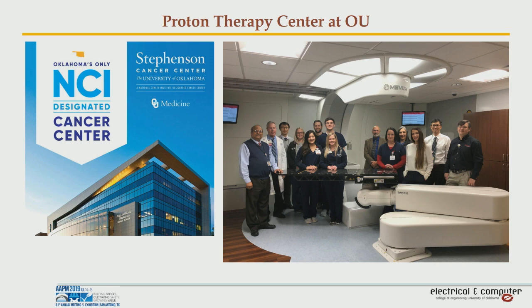We have a very interesting machine in the proton center, a synchrocyclotron proton machine, and luckily we can change the pulse width to a very small pulse duration, so it's likely to produce a high frequency signal. So we hope we can get a very good signal from the clinical machine. And I'm working with Dr. Yung-Chen, Dr. Ahmad, and the radiation oncology people to do the test.